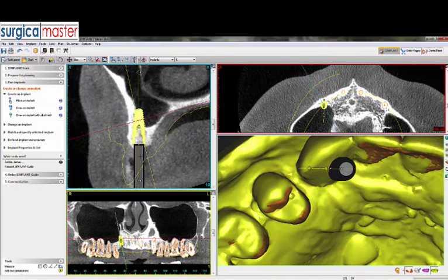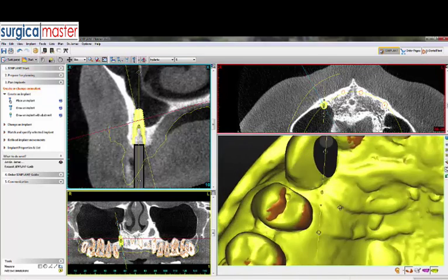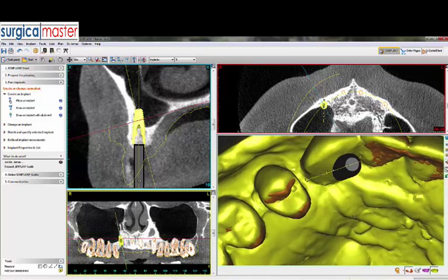You can start to see that this implant, at least at an 11.5 millimeter length, is going to be protruding into the sinus. This is an abnormal sinus that extends much more mesial than the norm, so we will have to do a sinus augmentation at the same time. That's a reasonable position.